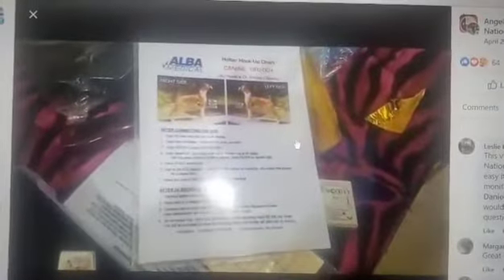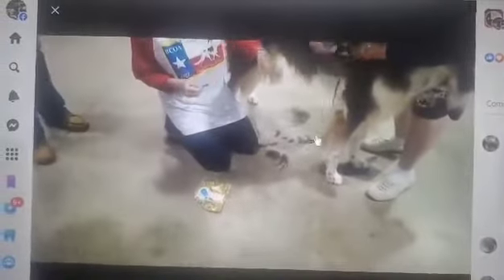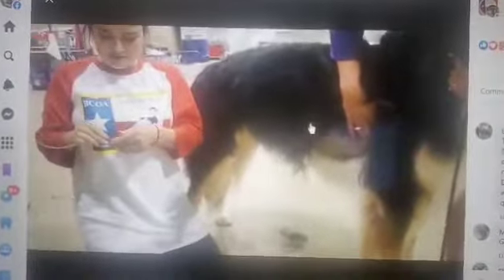I do red, white, and blue on the right. They're not actually red, white, and blue — these are red, white, and blue. The colors of the leads are black. Okay, I put the pads on the dog.